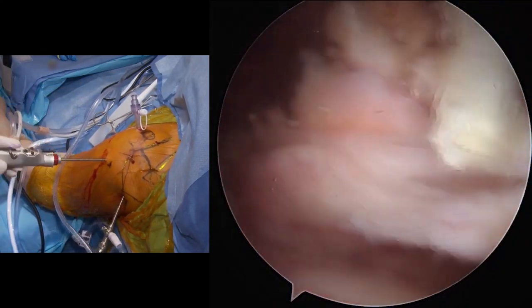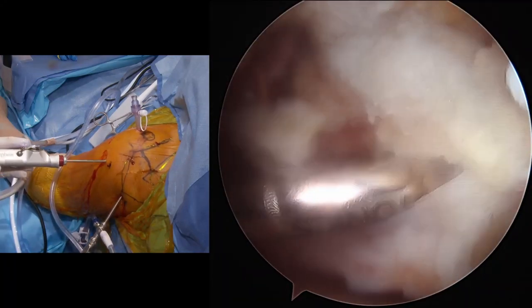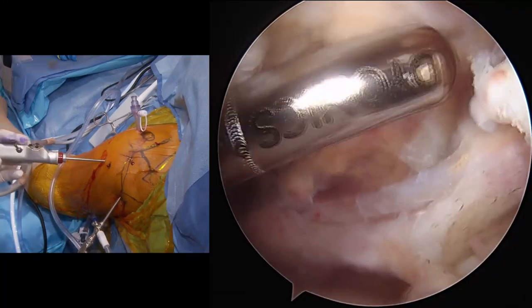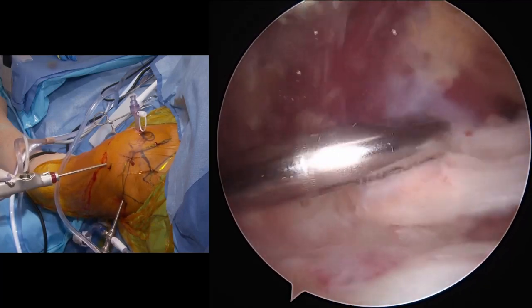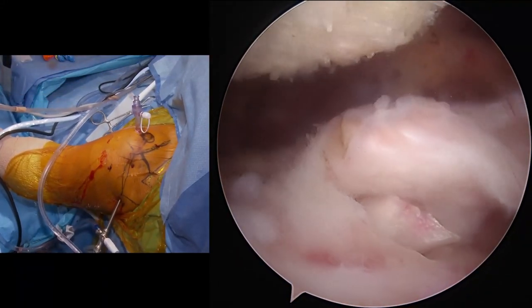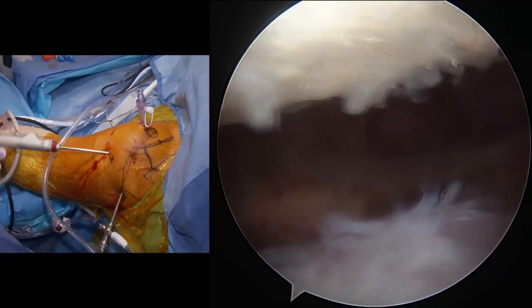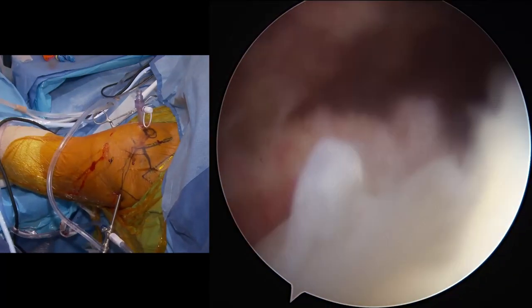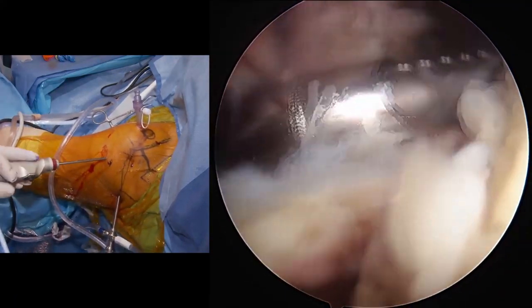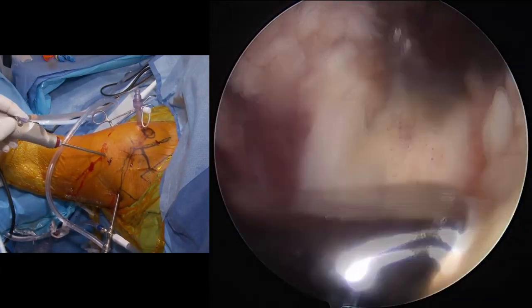All right, we're still trying to clean off the front of the shoulder so we have a view. And that's not the place to be. Bring the Mayo stand up here, please. Okay, right there. And then give me just a little traction on it, please. This is all fibrous thickening of the bursa, subacromial space because of a more recent injury.